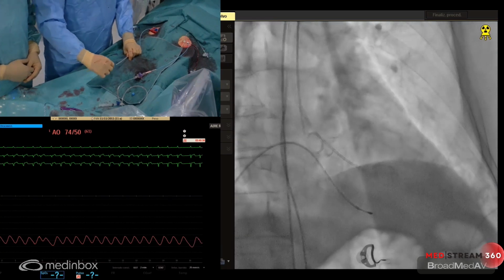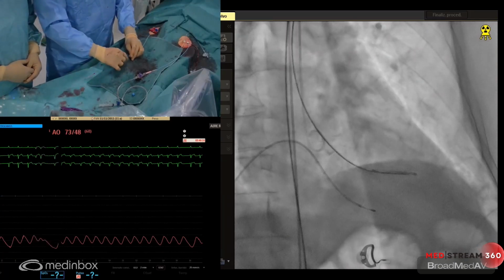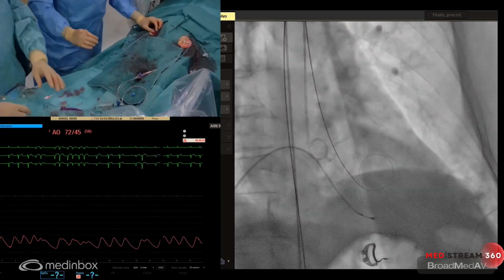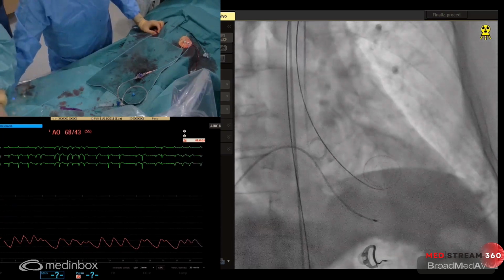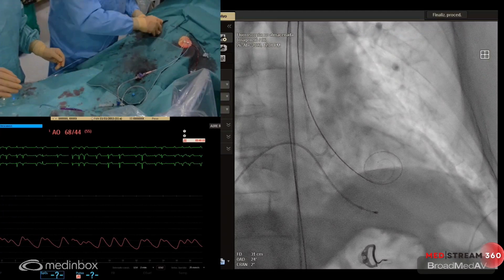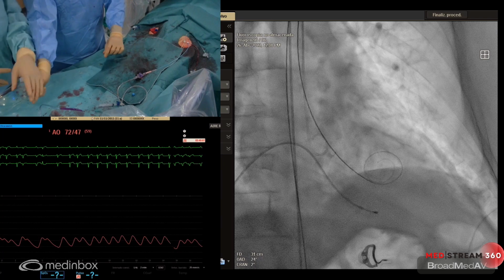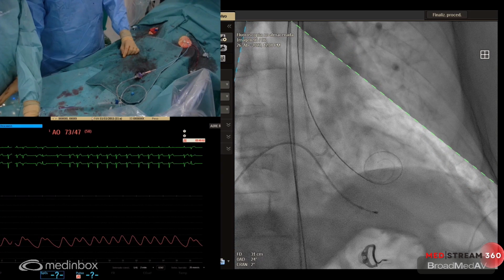Of course, this is always the theory, but as you know, sometimes when you have an occlusion of a coronary artery during a TAVR procedure, it is frequent that the patient didn't have any theoretical risk factor for occlusion, and also there are sometimes patients in which the risk theoretically is high, but you don't have an occlusion. In this case, the distance from the aortic annulus to the origin of the left main was low, but we think that we can do the procedure without protecting the left coronary artery.